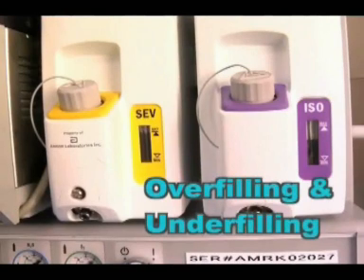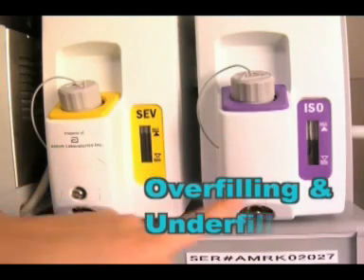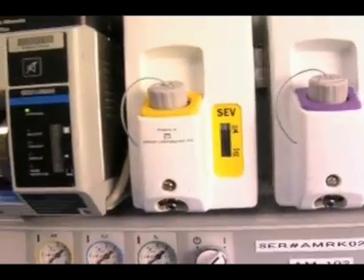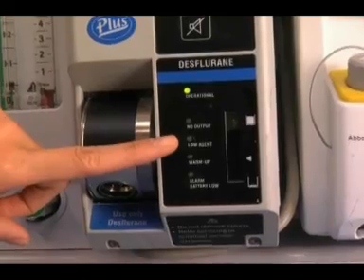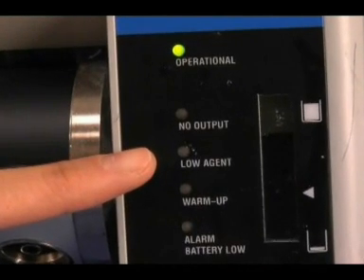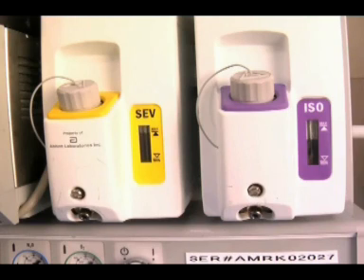Overfilling and underfilling. Improper filling procedures can cause patient overdose or a fall in vaporizer output. Most modern vaporizers are now equipped with side fill rather than top fill designs, which largely prevents overfilling. The desflurane vaporizer has a low agent indicator that comes on if the volume of liquid agent is less than 60 milliliters. The sevoflurane and isoflurane vaporizers do not have a low agent indicator. Therefore, it is important to keep a close eye on the levels.